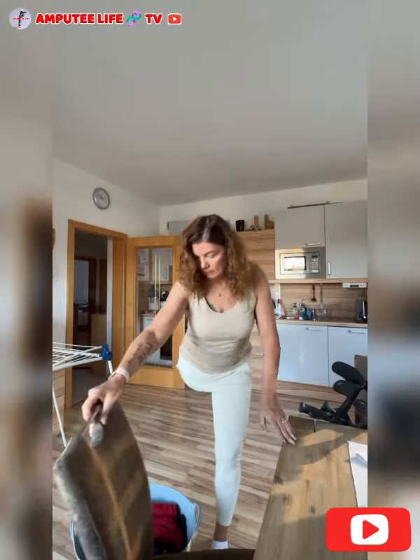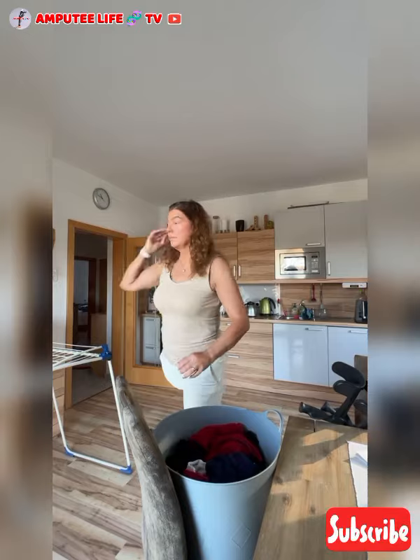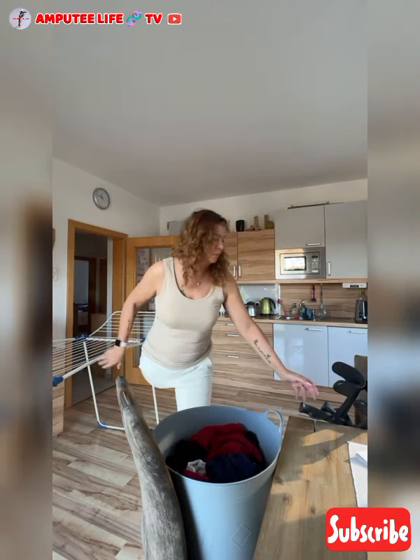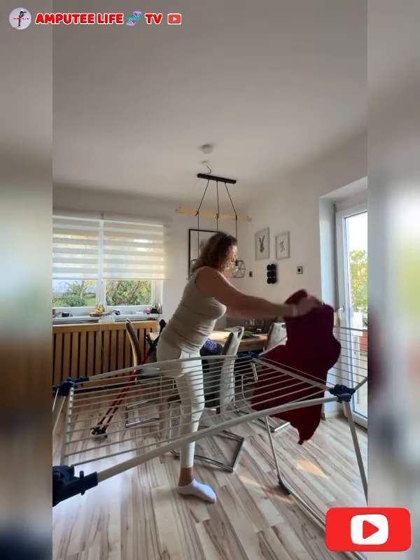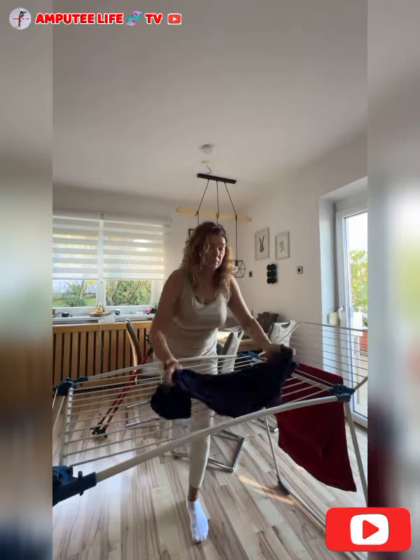Hi friends, welcome to Amputee Life TV, where we get to educate and give you a visual review of people living as amputees and how they navigate their daily life activities. Performing house chores as an amputee involves adapting routines and using assistive devices to maintain independence and efficiency.